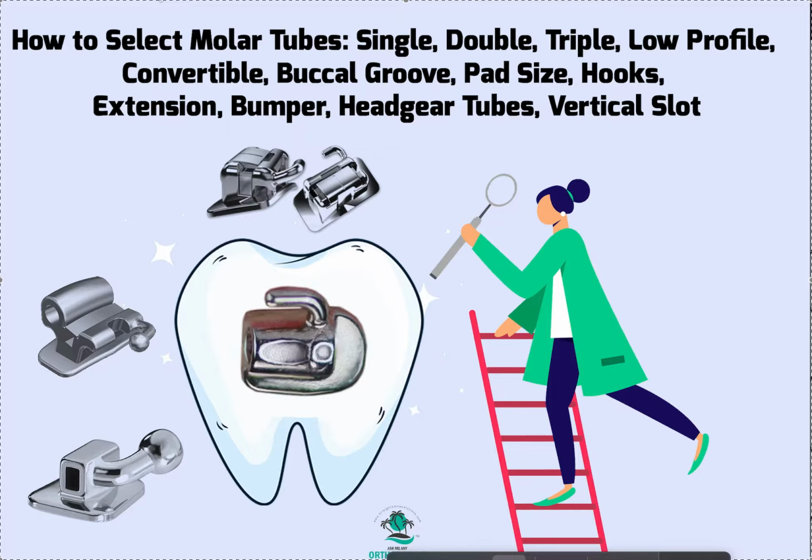In any case, if you get in the weeds, just ask the rep to pick the most standard thing. But let's go over what some of this stuff is and why you probably don't even need it. They're trying to get you to buy more stuff, right? Molar tubes that go on 6-year-old molars are slightly bigger than molar tubes that go on 12-year-old molars, the sevens. You don't even usually need to band or bond second molars. It's usually more of a one-off, maybe towards the end, definitely not at the beginning. So I wouldn't buy too many of those because you may rarely use them, and you may be doing pretty simple cases.